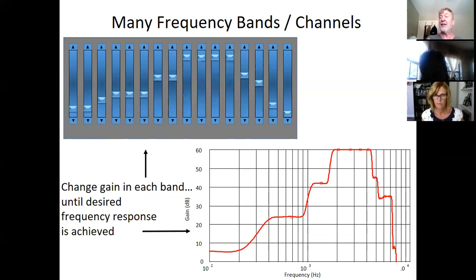We're nearing the end of compression in this course. We're now going to move on more toward digital features. And noise reduction is a big one. I mean, digital noise reduction is a major concern. It's touted and hyped by all the newspapers. People come in waving, saying, "I want the hearing aid with noise reduction." Well, they've all got digital noise reduction.